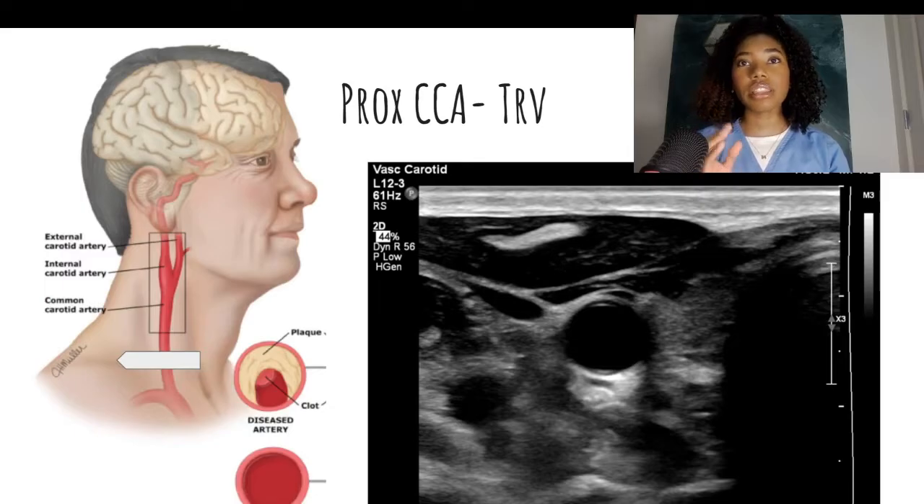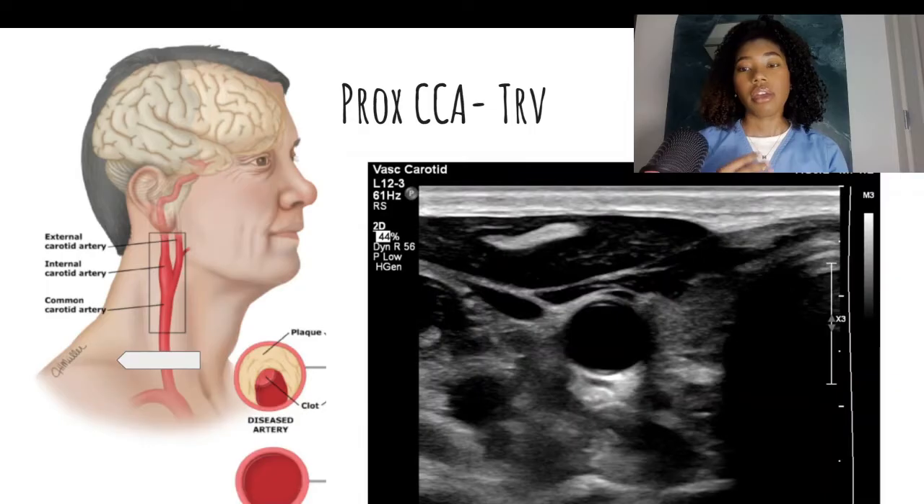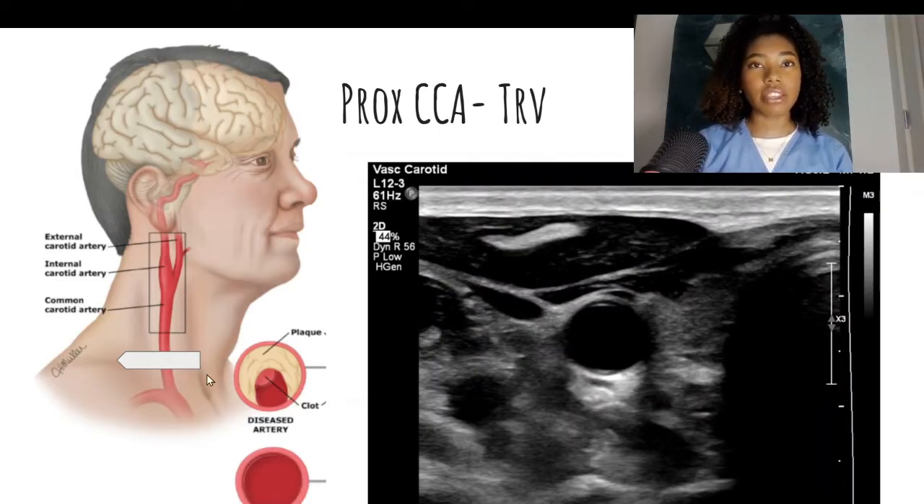I usually get the patient to turn their head to the opposite direction from the side that I'm scanning. Most facilities require you to get transverse images, so that's where we're going to start. I like to begin at the base of the neck with the notch of the transducer facing yourself. This little arrow indicates the direction of your notch on your transducer, and I have the corresponding ultrasound image over here. This is where your transducer should be — the carotid artery should look like a circle in the center of your image.